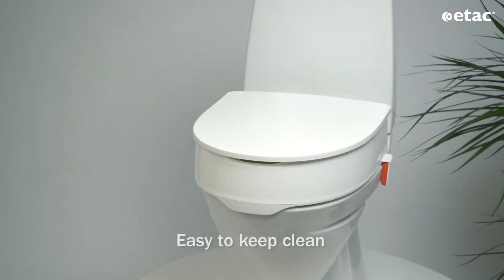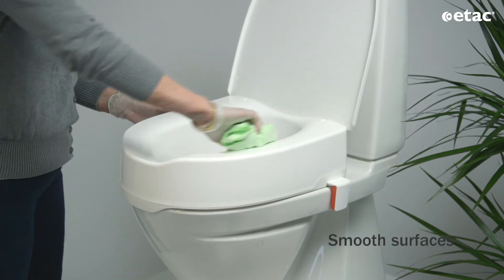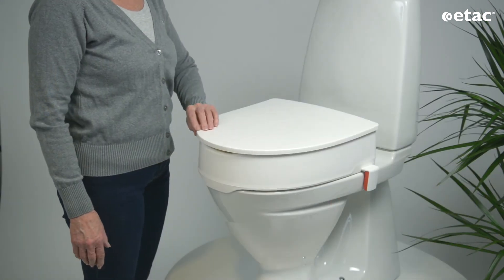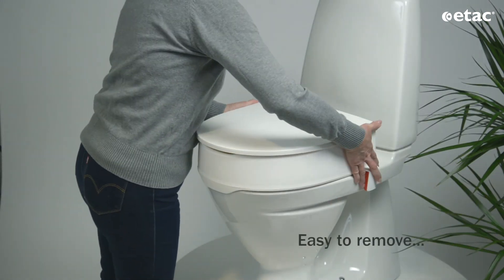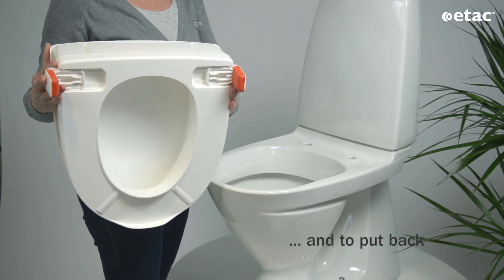MyLoo with Brackets is easy to keep clean, thanks to the smart design. The raised toilet seat has smooth surfaces and is easy to clean with a soft cloth. Should separate cleaning be required, it's easy to remove the seat and put it back in place.